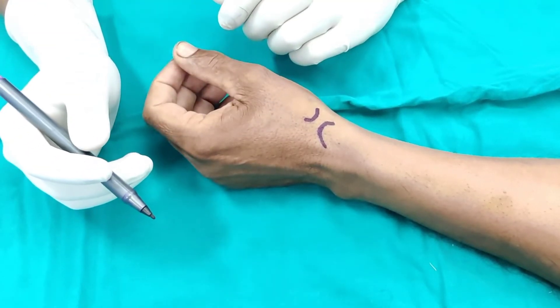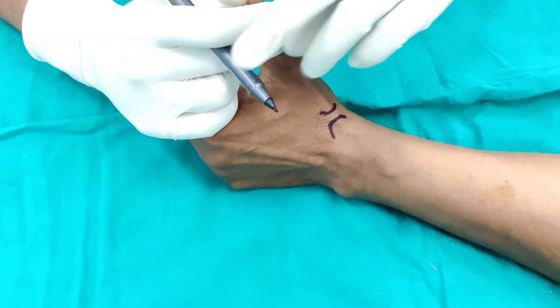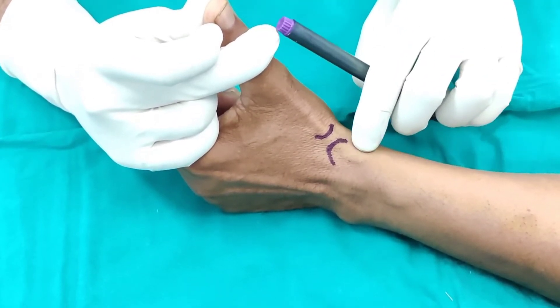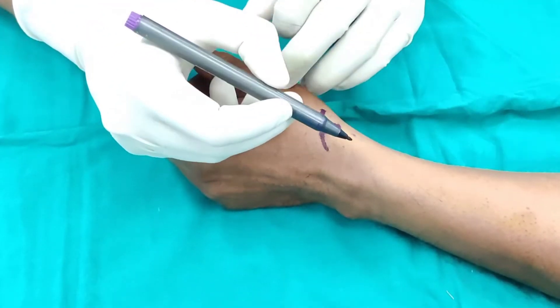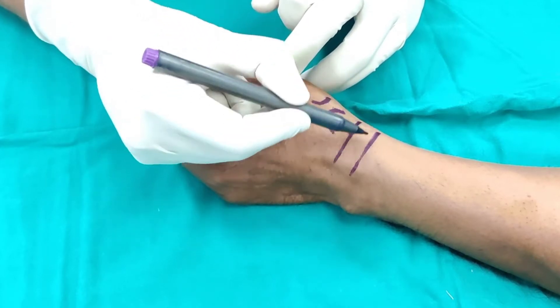Now if you want to feel the tendon, ask the patient to do the thumbs up. As he does the thumbs up, you can see that the tendon here becomes prominent. These are the tendons that we will be injecting. Just distal to the styloid is our extensor retinaculum.